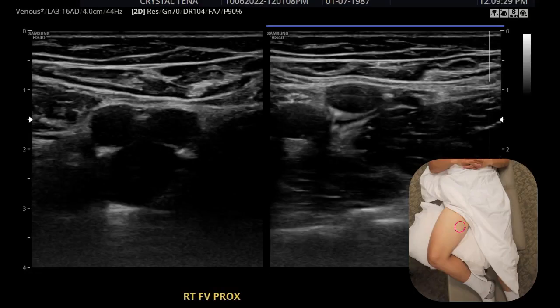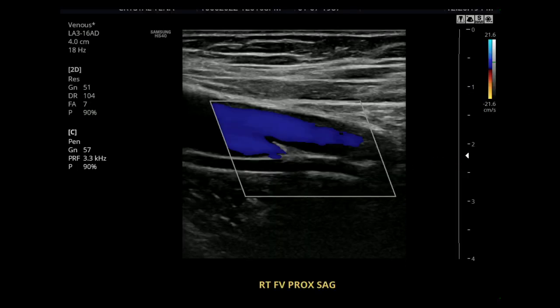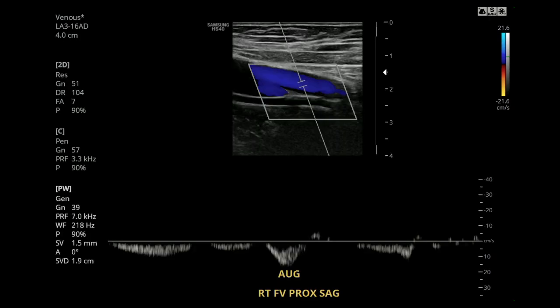For the femoral vein proximal, you're going to be looking in the same area as the deep femoral vein. The only difference is you're going to be getting the vessel that is anterior. This is the color for the femoral vein proximal. Again, you're going to want to show the femoral vein proximal and the deep femoral vein together, along with the augmentation for the femoral vein proximal.